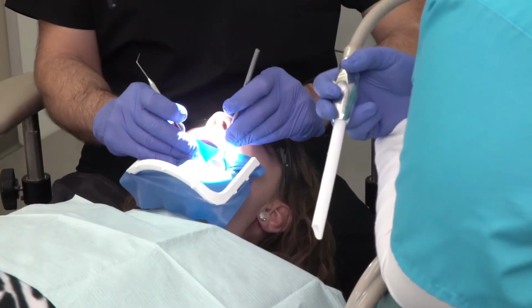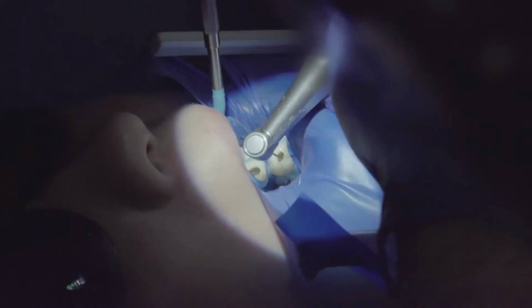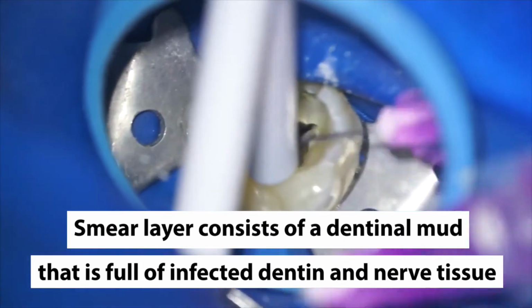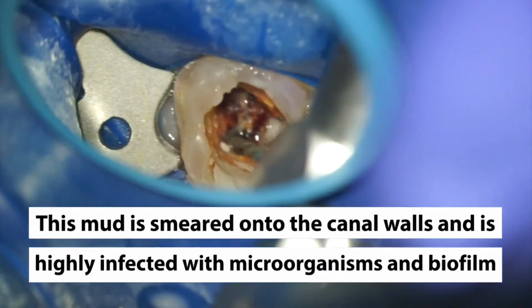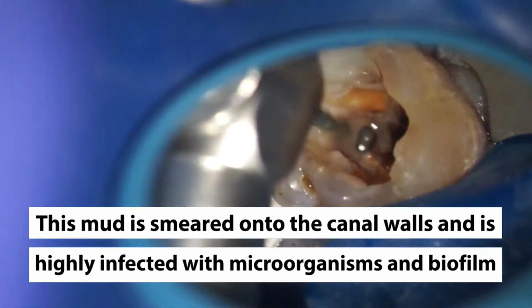During the process of shaping of the canal with our hand files and rotary instruments, we do create smear layer. Smear layer consists of a dentinal mud that is full of infected dentin and nerve tissue. This mud is smeared onto the canal walls and is highly infected with microorganisms and also biofilm.